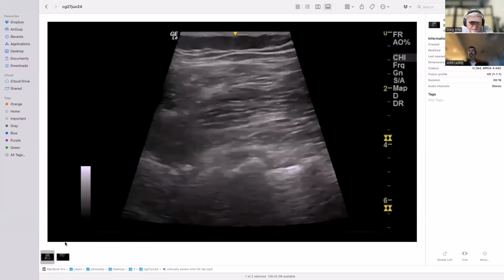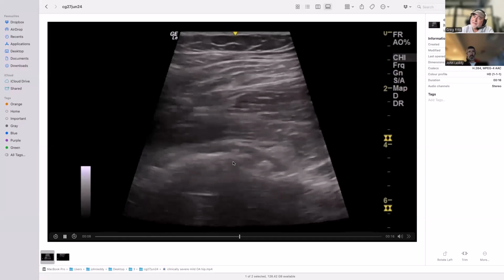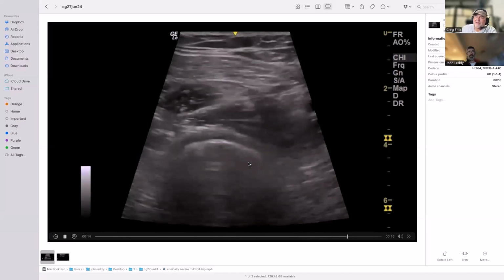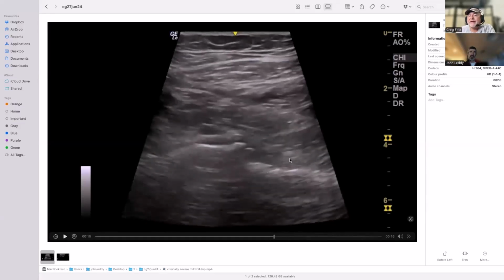This was, I get hips through that where the x-ray has said the arthritis is mild. And yet I see quite a lot going on at the inferior border of the femoral head. And these are often quite symptomatic, particularly into flexion. I don't know whether you got the geography on that, because it's not the best clip in the world. This is where the femoral head starts to come down to the neck. Normally you get a nice smooth curve roll off and down onto the neck. Well, here this is all osteophyte.